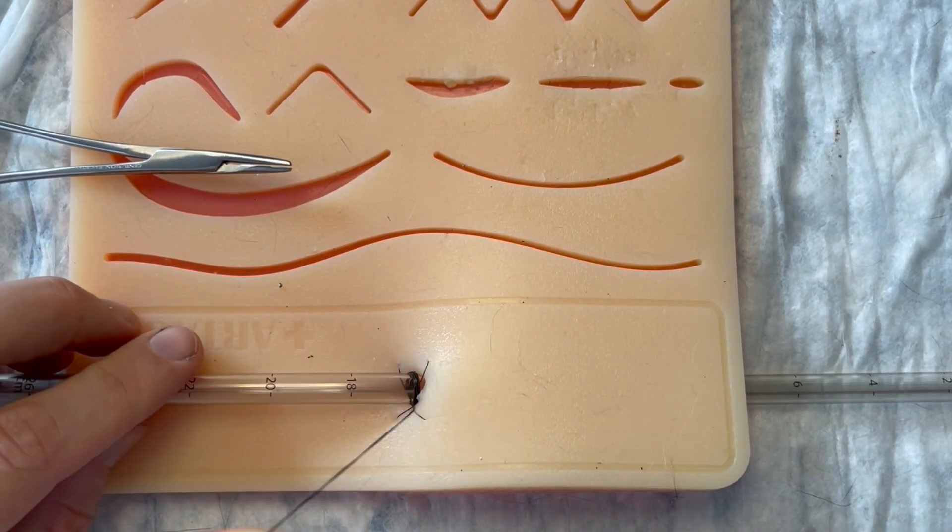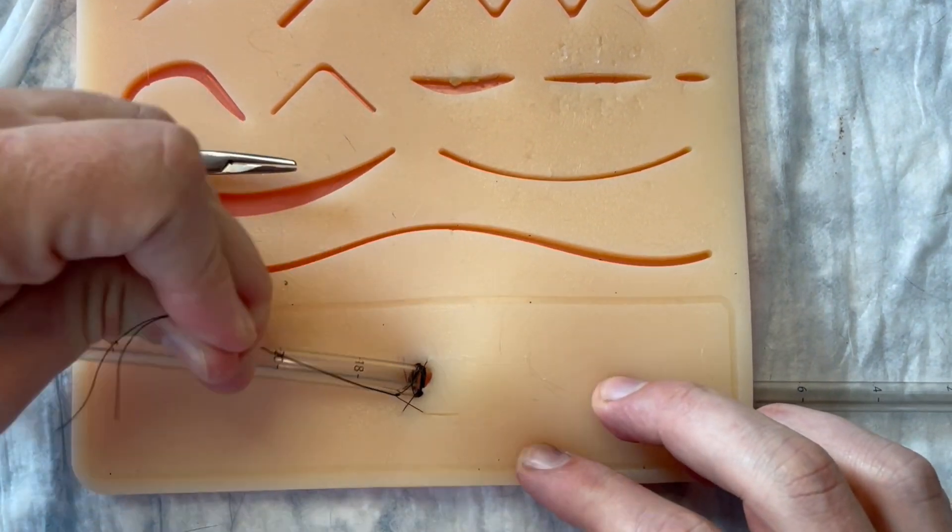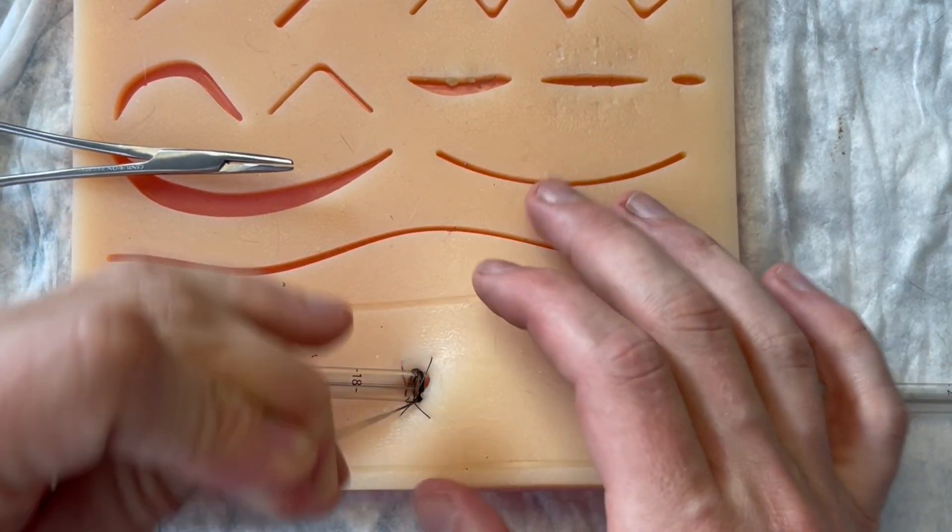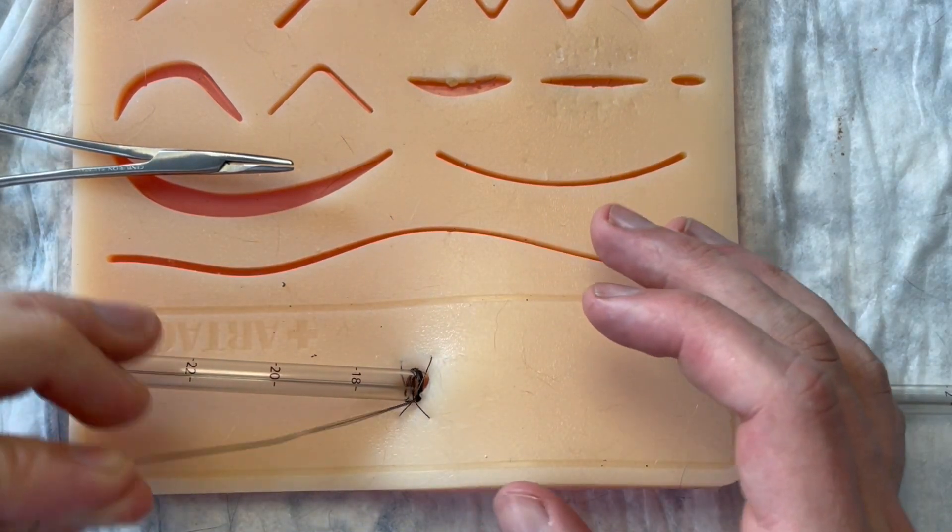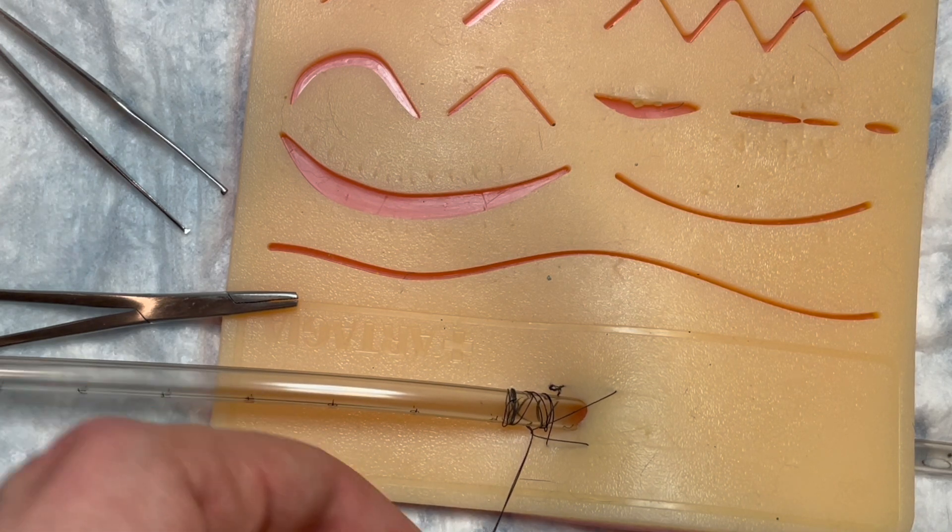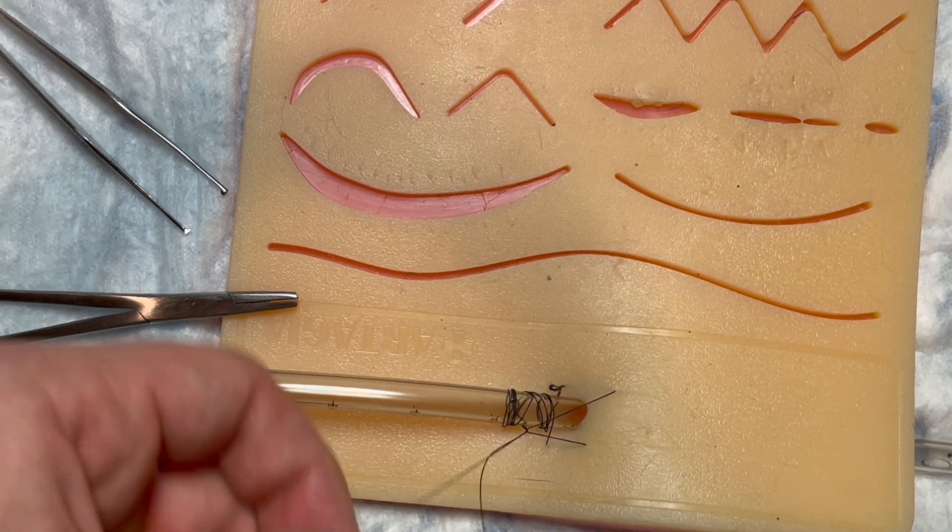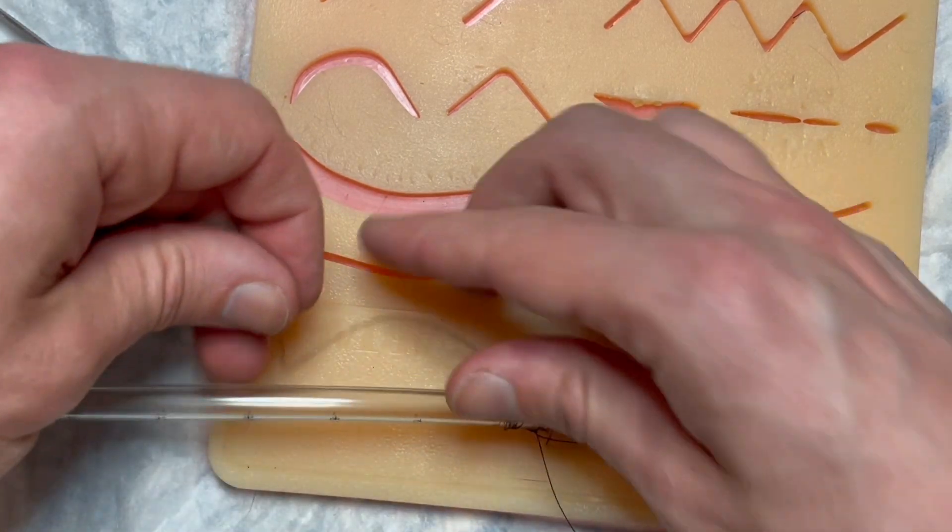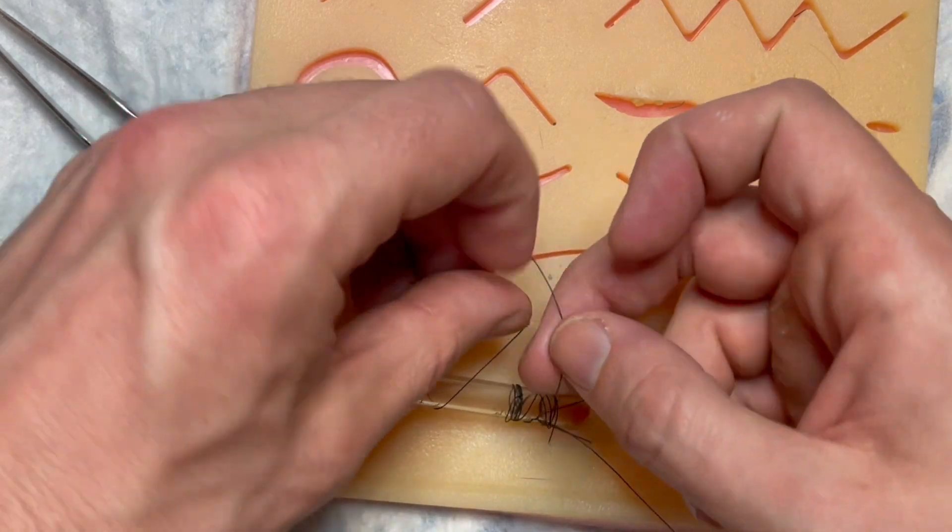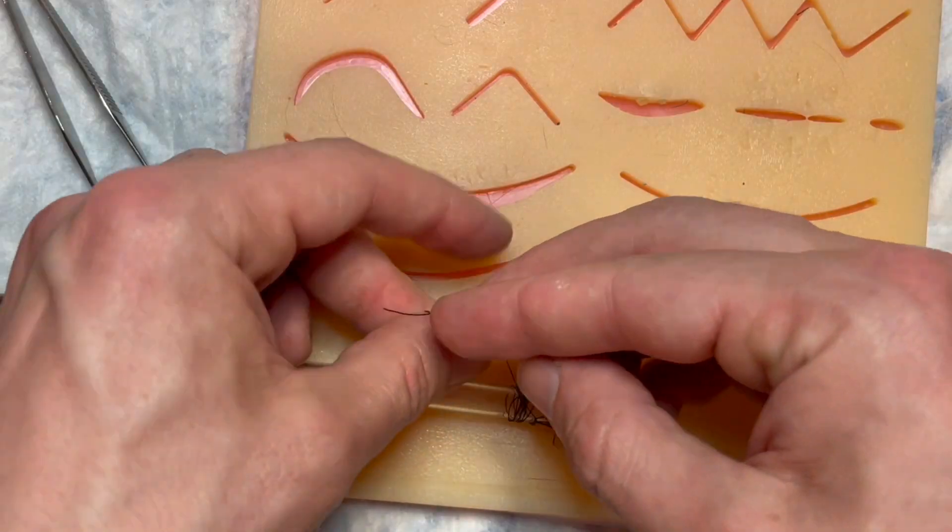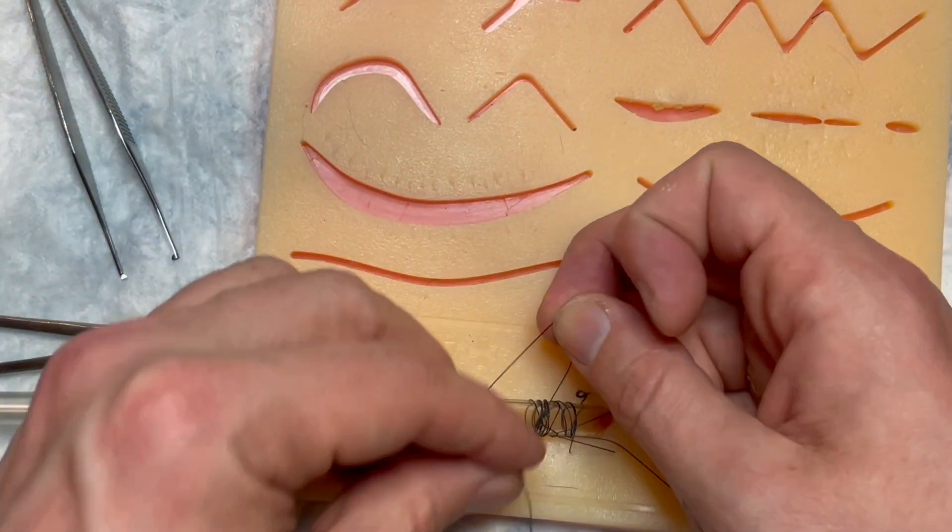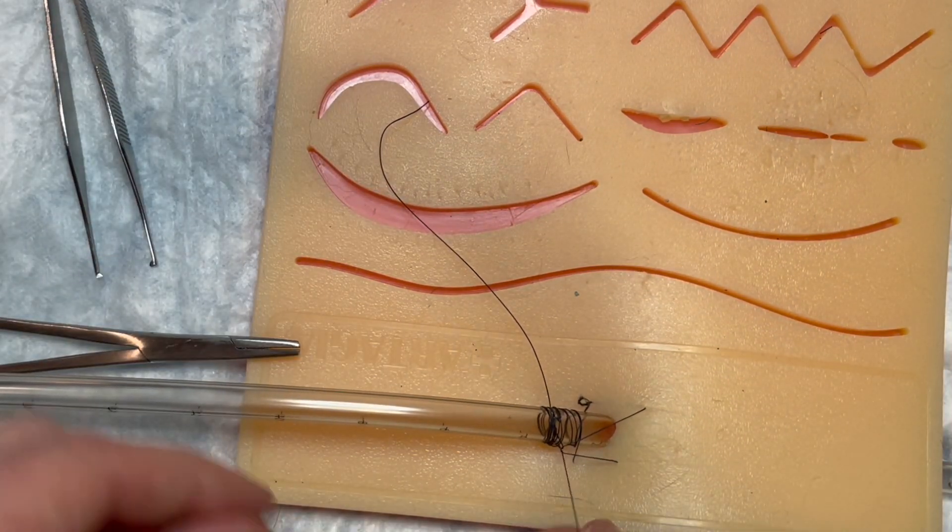That string here. So now when we come back we've created this anchor of our knot and when we pull this way it's kind of creating more tension here and it's just a really nice secure knot. And now what we can do with this, look now we're back in our L mode here again, so we could do a couple L's. Number three L's for each side, now we're just going to move on to the right side.